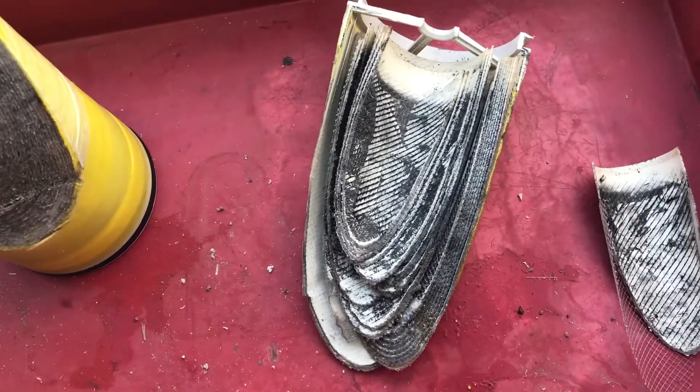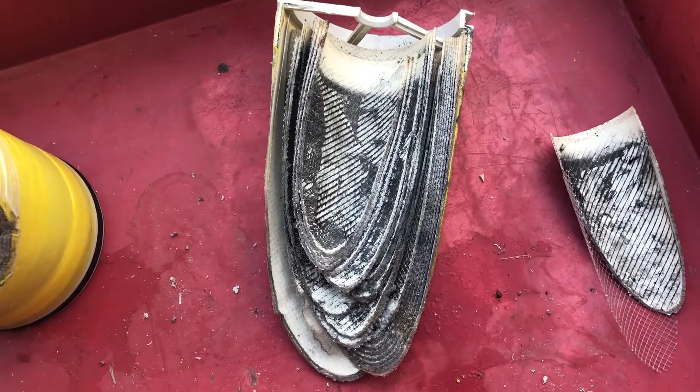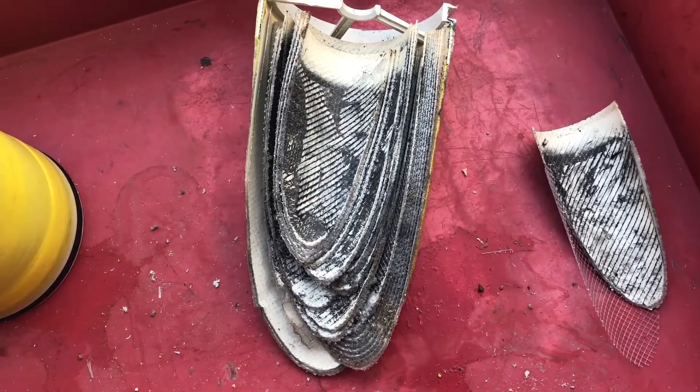The WRO 300 membrane was fouled. I replaced it and now we're making good water again.